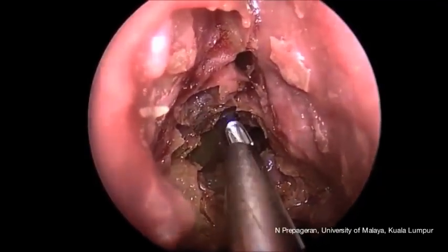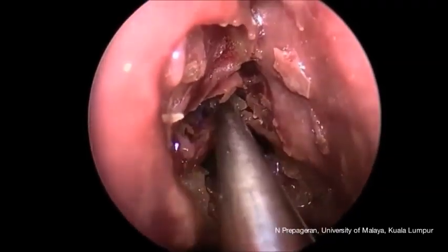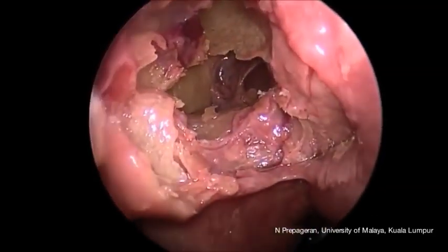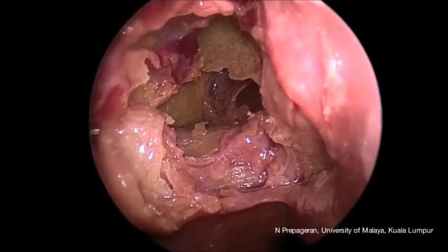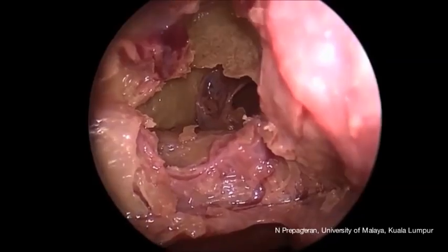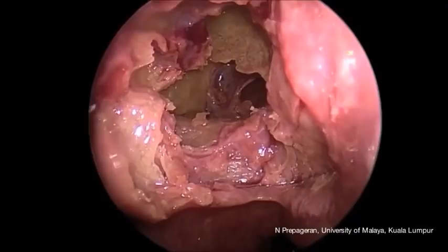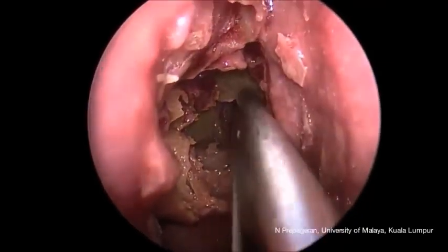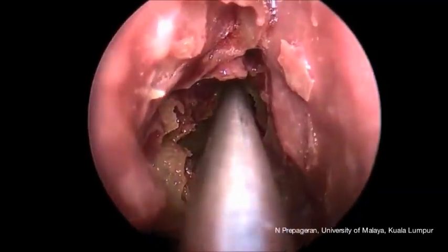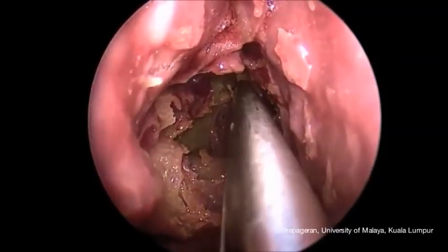Now we're going to use a Kerrison punch to remove the bony ledges. It's very safe by using this instrument, because then we will not accidentally dissect or enter into the skull base. By using a Kerrison punch, we are able to appreciate all the vertical ledges that come from the skull base itself, and we can remove them. And again, lateral to the ethmoids is the lamina papyracea. We're using the Kerrison punch now to remove the vertical bony ledges.